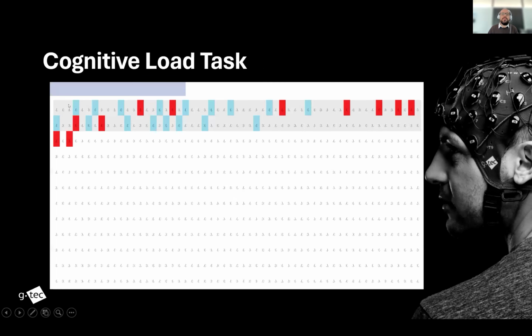And then they have to do the cognitive load task, which this time is a bit different. We just made it more complicated for them. They will have to look at three really small points and click them through. They will have 15 seconds per line. So we have here 12 lines, and you will have to complete each row task within 15 seconds. Otherwise, the bar will just block and you will not be able to click it.